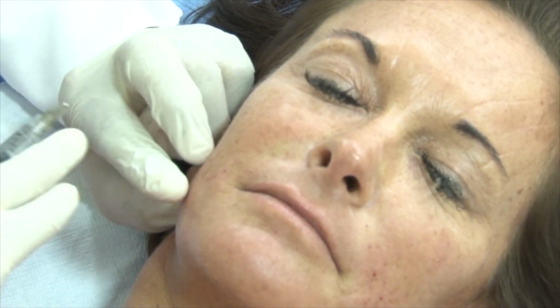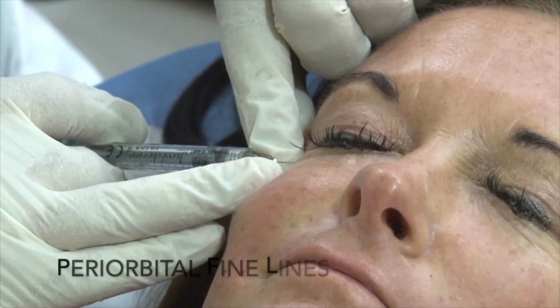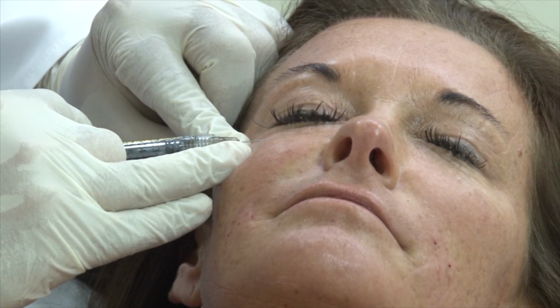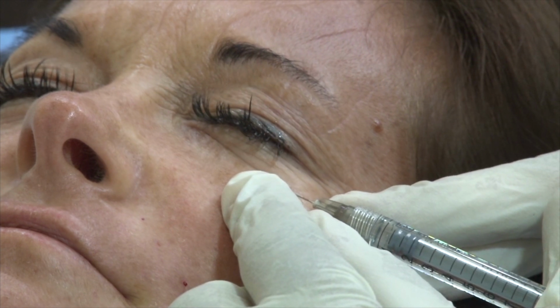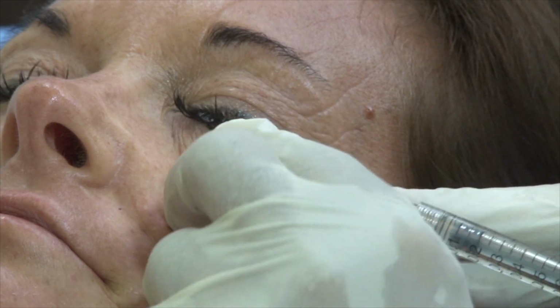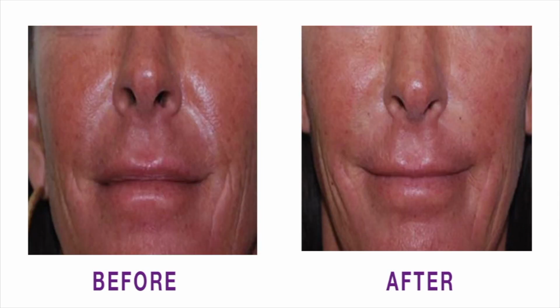Ask the patient to smile to see the direction of the line and just inject it intradermally or subdermally, small quantity. This is correction of periorbital fine lines. I'm using a very thin filler material, just injecting in the superficial plane underneath the line, and a tiny aliquot of filler will help improve these fine lines and wrinkles. This is the before and after of that patient. Just focus on the fine line, how it is corrected by placing intradermally.